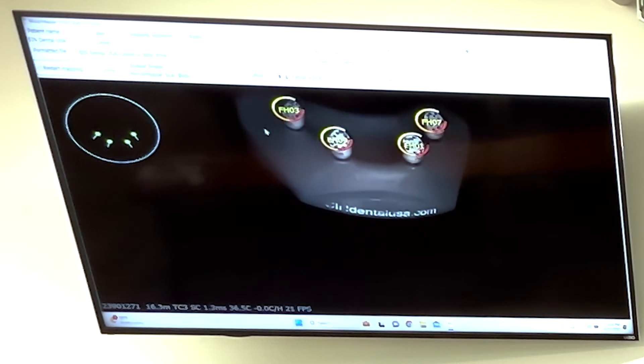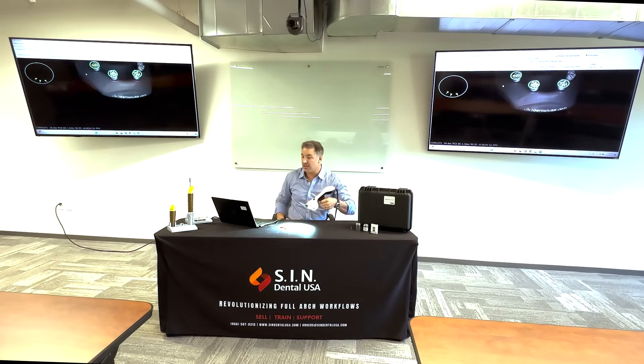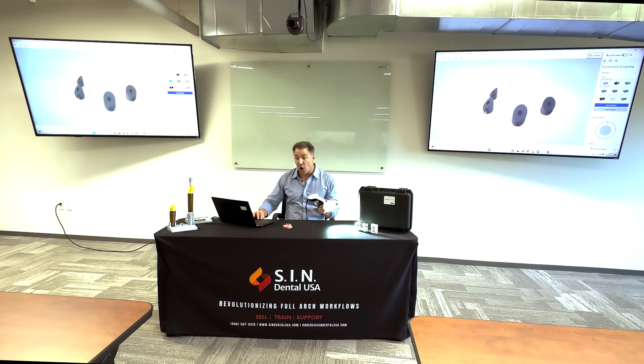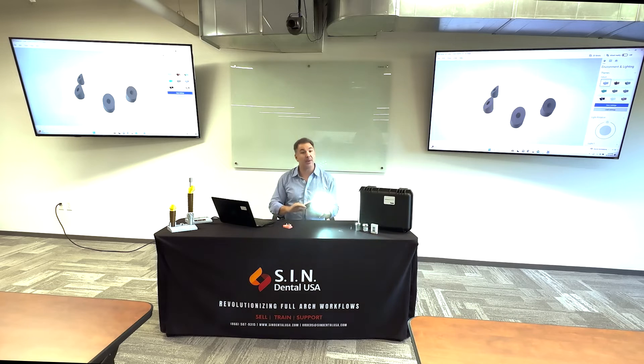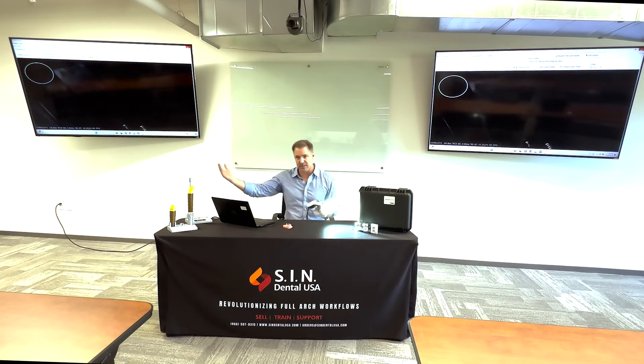You'll notice green dots on screen — you want to center those green dots in the camera around the white circle. Immediately after the file has been captured, it automatically pops up. You get a good visual of whether you've captured all the implants in the patient's mouth. I look at the patient's mouth — there are four implants. I look at my screen — I see four implants. Everything looks good. It's all done automatically, and I can immediately close out, access that file, and send it to the design team.